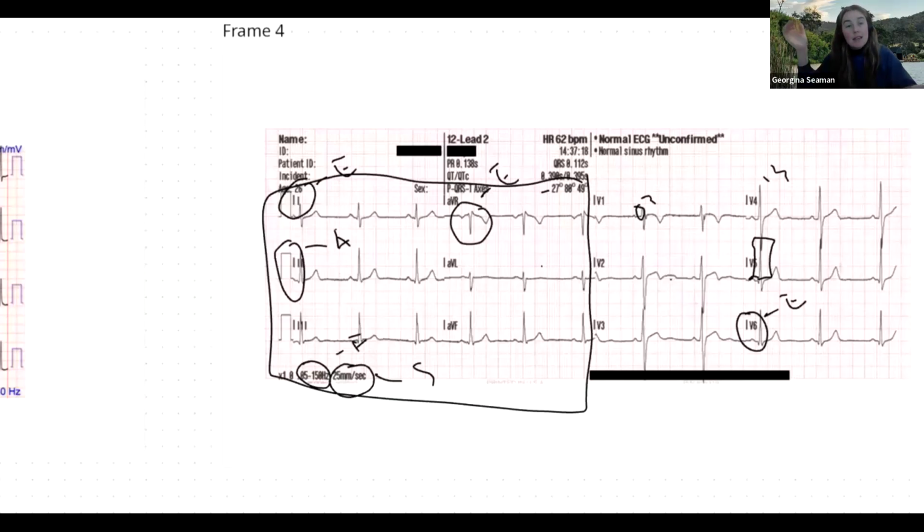But realistically, what we see is, how do I explain this more simply? We still see the left ventricle either way. The left ventricle kind of overpowers it, but because we know what's normal and abnormal for the left ventricle, that's when we can see that there might be something wrong with the other part of the heart, because we're saying that if it's not going the normal pattern, why is it not going the normal pattern? Is it going towards somewhere else?